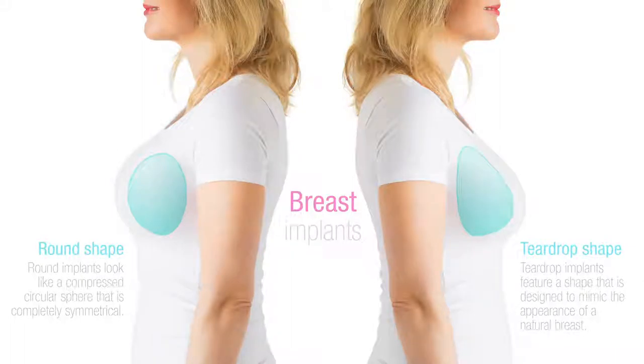Saline has technically less risk because it is salt water, but with implants made so well today, it's pretty plausible to say that the risks are almost even at this point. So gummy bears, we use them for nice, highly projecting implants with low width and also to keep its form and shape. And there you go — gummy implants 101 and 102.